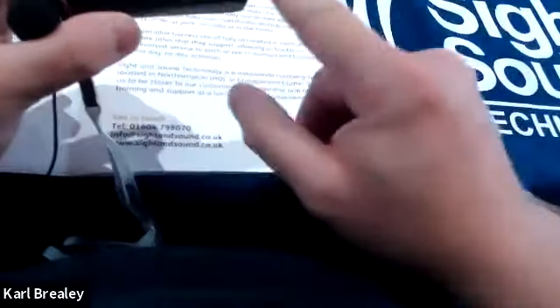Right. Now, what I've done there is I've captured the image, but I've managed to now control what it's doing. Halfway through this, I've just double tapped the device and it's paused the text. I don't know if you can hear that bleeping. I'm assuming you can because it is right by it. That's just telling me it's in a different state. Now, while it's in a reading mode, you can change the volume. It gives you the opportunity to go up and down. It won't tell you it's doing it, but you can obviously tell it's getting louder.